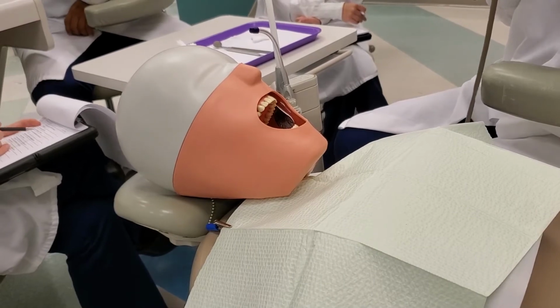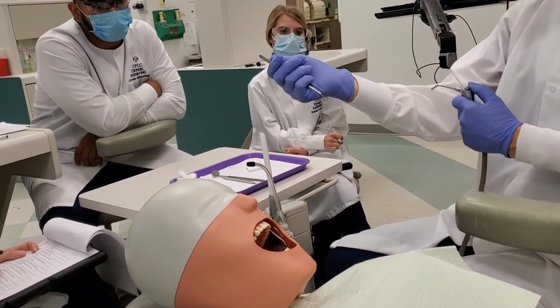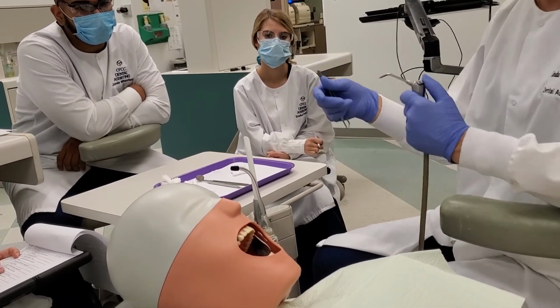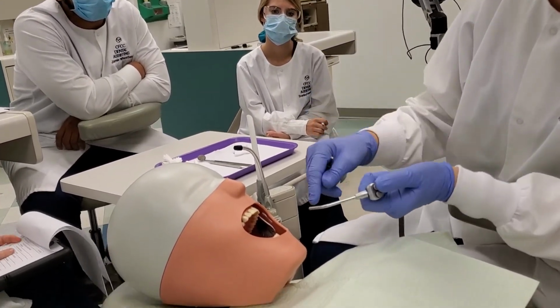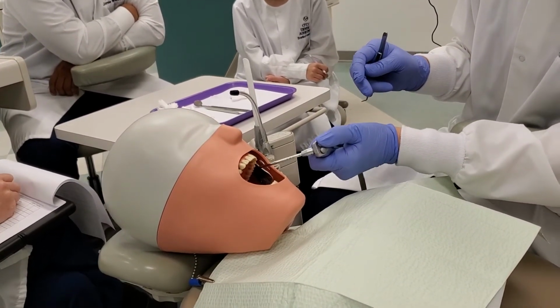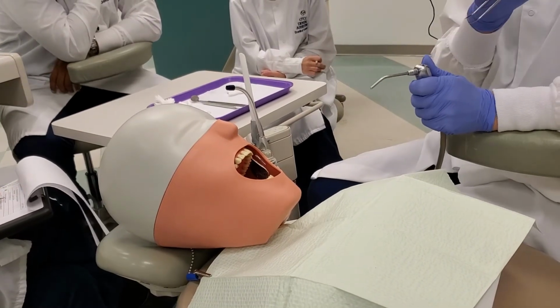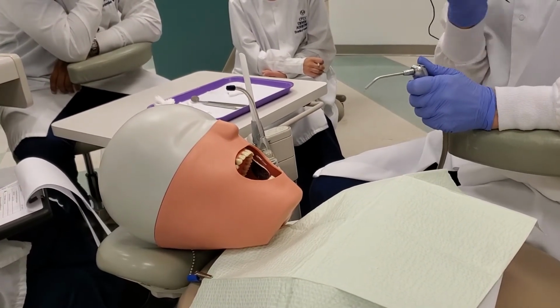Dry the tooth with short puffs of air. Again, so you're just drying the tooth, so you can make sure that you clear the air, clear the water from your thing. And I'll do the same thing. I'll do like number 14. So we're just going to dry it. Dry tooth number 14. Okay? And then now we're going to remove all the absorbents. Use water. That's what it says.